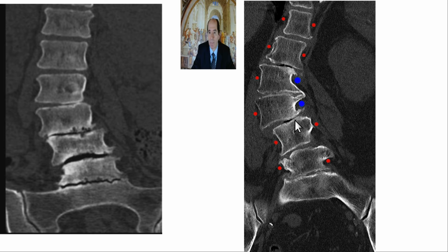Once they're thrombosed, that means they don't provide good blood supply to this disc, and the disc can just fail. It'll crack, it'll dry out as a desiccated disc. This would be gaseous disc degeneration. You can see there's asymmetric disc-based narrowing, much worse on this side where the lumbar artery is occluded. So that's the mechanism of asymmetric degenerative disc narrowing due to ischemia through occlusion of the same-sided, ipsilateral lumbar artery. Okay, that's what it looks like.